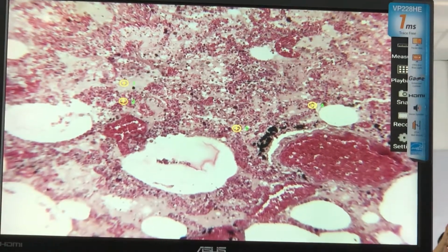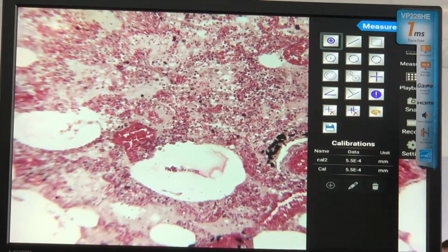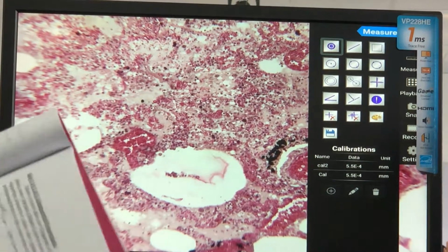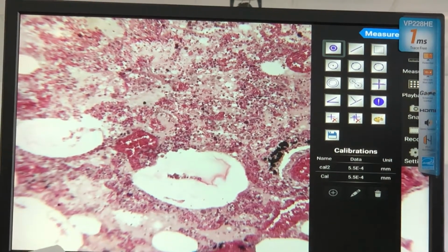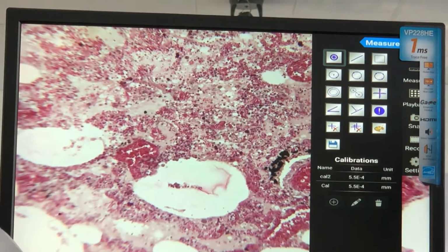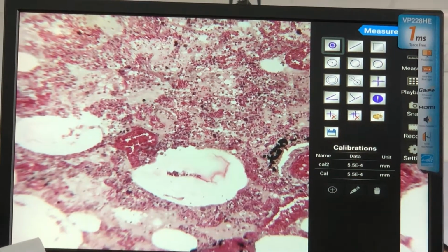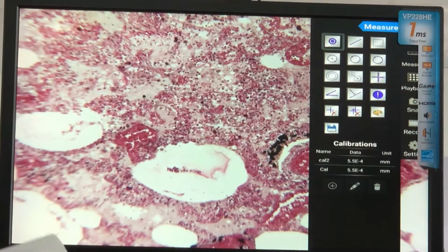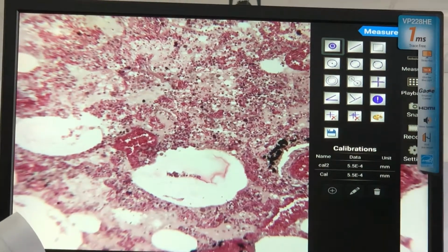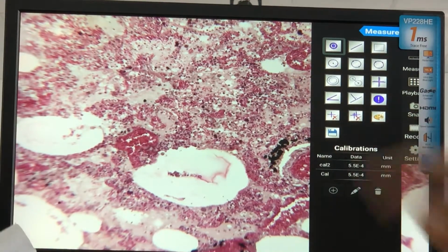We go to one of my favorite slides because this will surely come out in the practical exam, and a lot of questions could be asked, starting from the easiest, which is making your pathologic diagnosis, to the most difficult, where I will point to each of the pertinent structures that will help you make your diagnosis. So this is congestion, chronic passive congestion of the lungs. This is slide number 26.